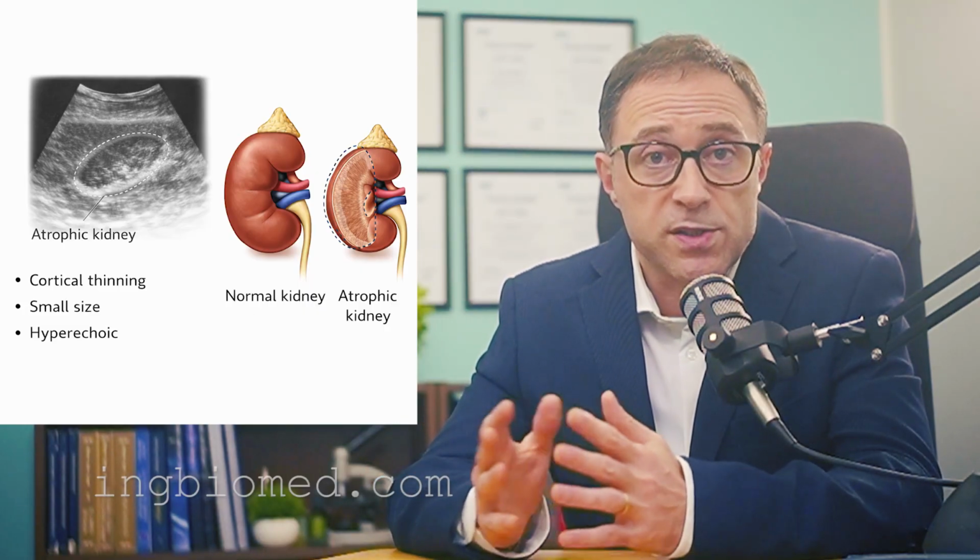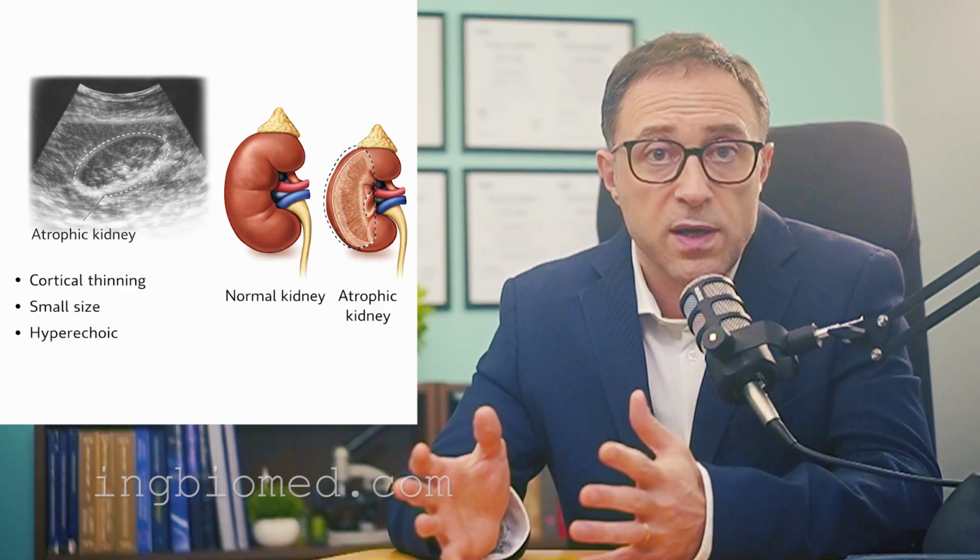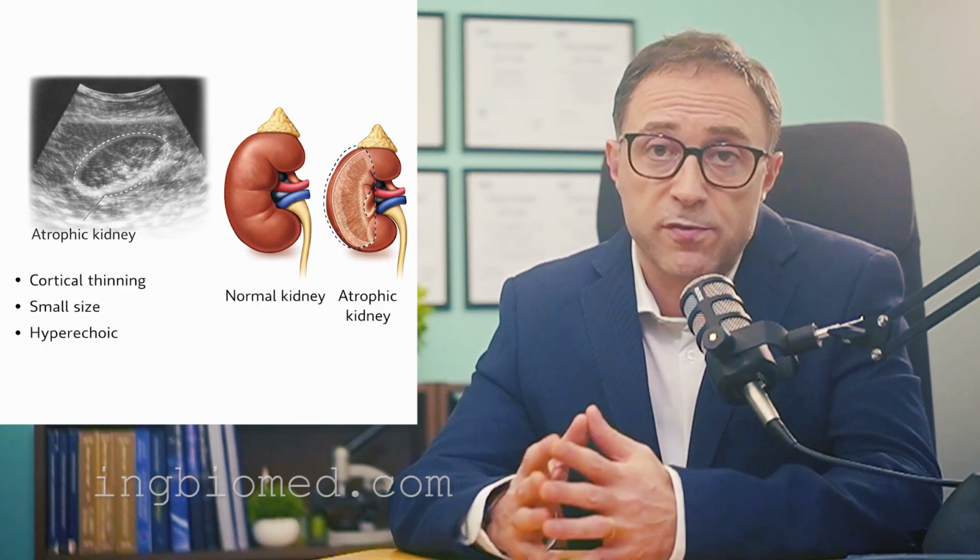In advanced stages, the kidney becomes small, hyperechoic, and poorly differentiated. In a unilateral small kidney, comparison with the contralateral side and Doppler evaluation of perfusion are essential to distinguish congenital hypoplasia from acquired atrophy.